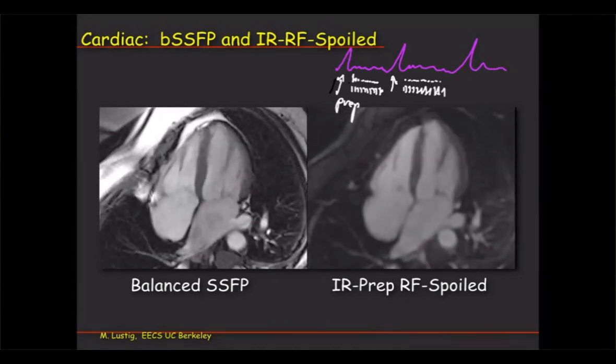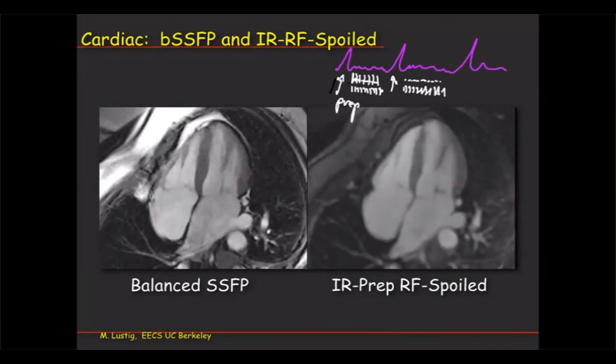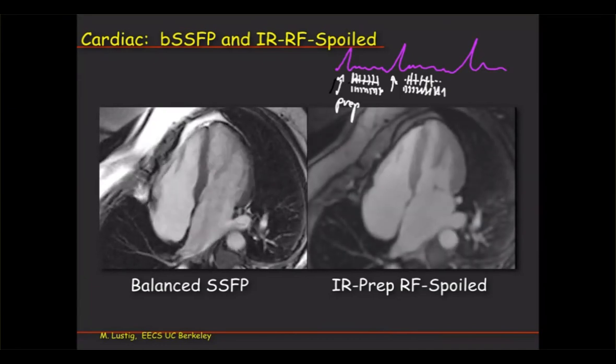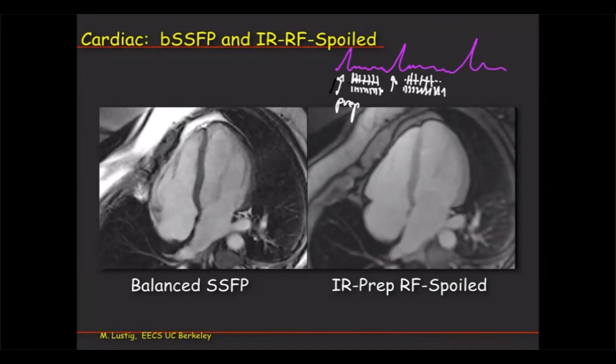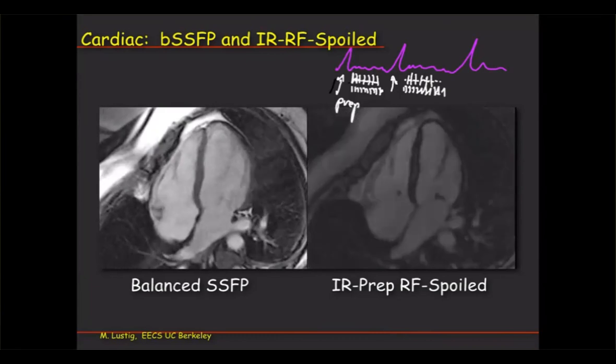Okay. So that's why we get a lot of images. Basically, we get an image for every time here. But then we need 256 cardiac cycles in order to finish an image, right? That's a lot of cardiac cycles. So you have to do a long breath hold. I don't think anybody can do a 256 cardiac cycle breath hold unless the heart rate is really fast.